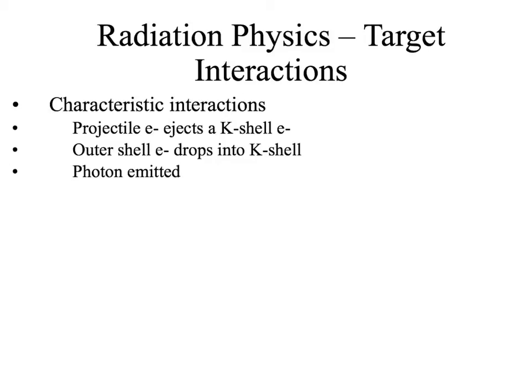In CT, we're going to additionally filter in kind of a shape. So this is what this little bow tie is up here. In CT, we use a bow tie filter. Let me try drawing it on this thing rather than on the whiteboard. Because my body is basically tube-shaped, we're all like hot dogs walking around, right, according to the physicists. So I'm basically hot dog shaped if you look at me axially. And so I can apply a bow tie shaped filter to that, and it's going to filter out the x-rays on these sides more, because we're imaging something that's basically tubular. Does that make sense? Okay.